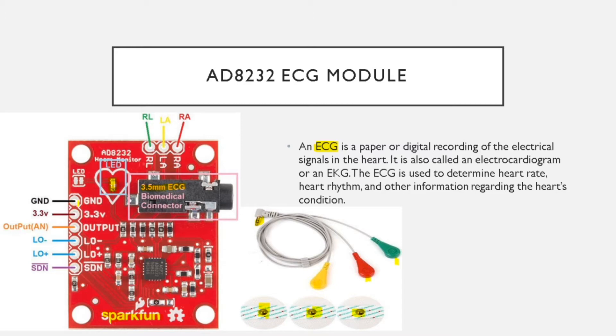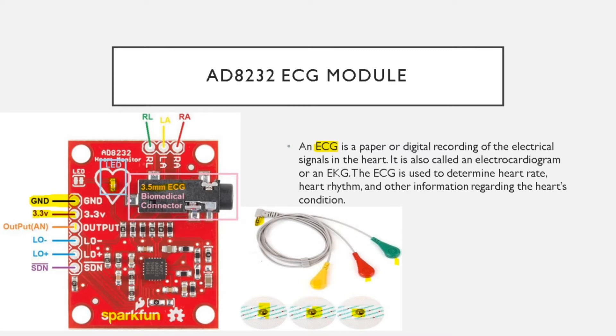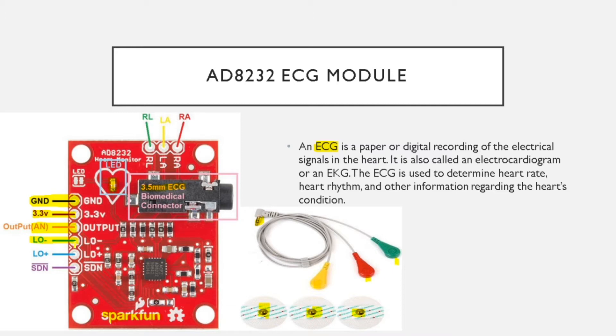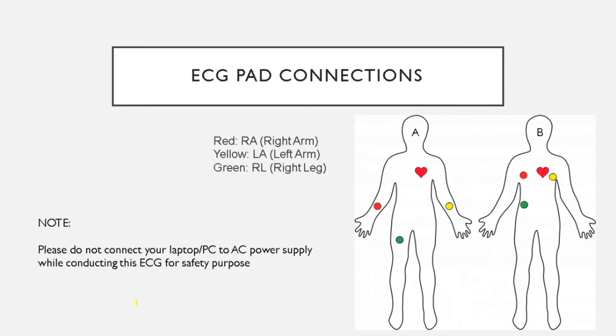Looking into the pinout of the module, here you have a ground, the 3.3 volt pin, an output pin which has to be connected to the analog of the microcontroller, and a LO minus pin which has to be connected to a digital pin of the microcontroller, and LO plus pin which has to be connected to a digital pin of the microcontroller.